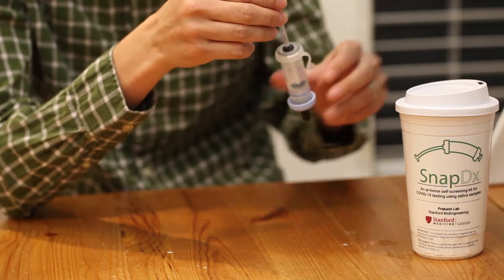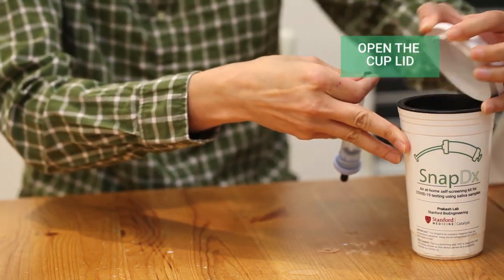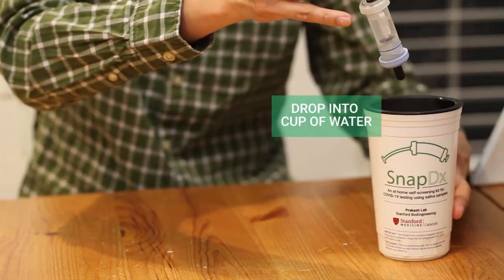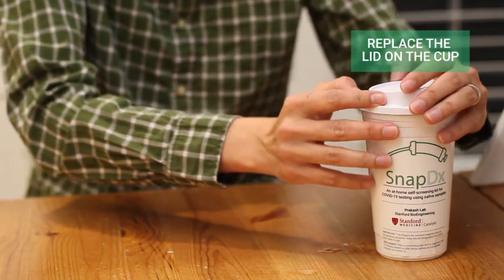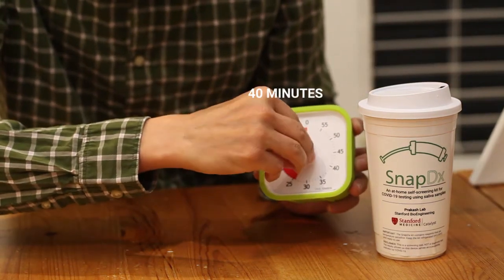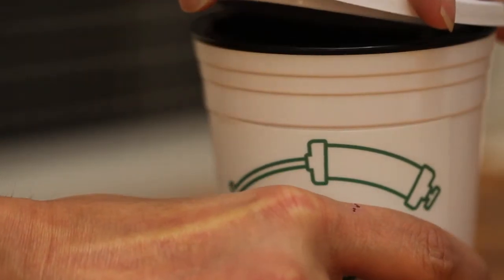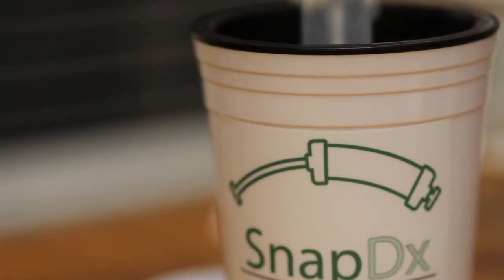Step 6. Now remove the lid from the cup of hot water and drop the SnapDx tube into the cup of water with the blue cap facing down. This time, do not use the clip and allow the SnapDx tube to be completely submerged in the water. Then reattach the lid onto the cup and leave the tube in the cup of water for 40 minutes. It is during this time that the amplification reaction is running within the plunger. After 40 minutes, remove the lid and carefully remove the tube from the cup and dry the tube and plunger.